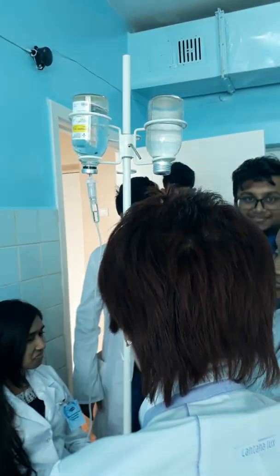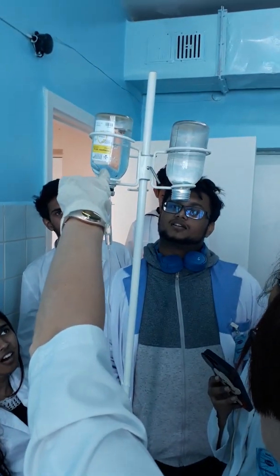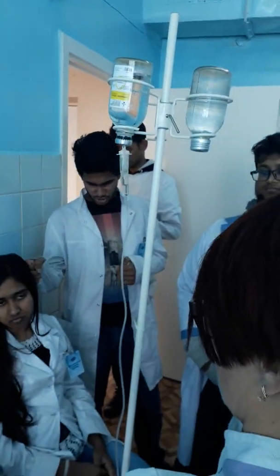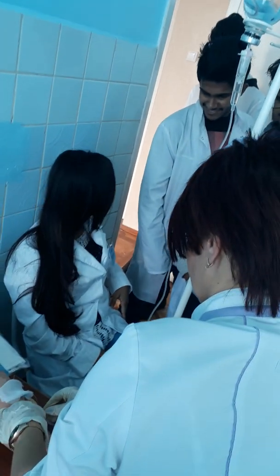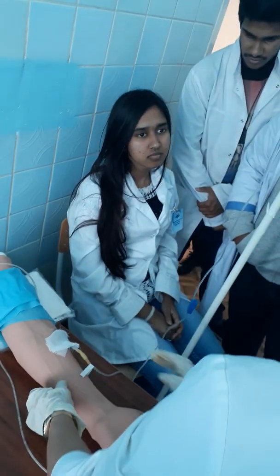And after that, you open. Maybe now it's in this well with negative pressure, and when you open, you see the solution finish. After opening, you ask your patient, what do you feel? Check this part again. How does it receive? And again, do the same.